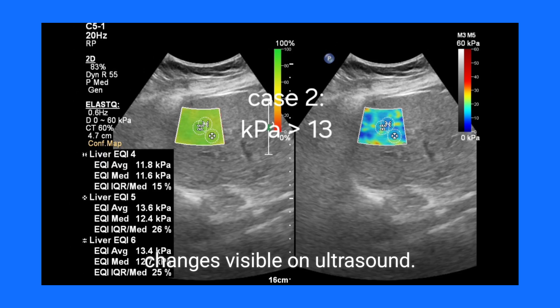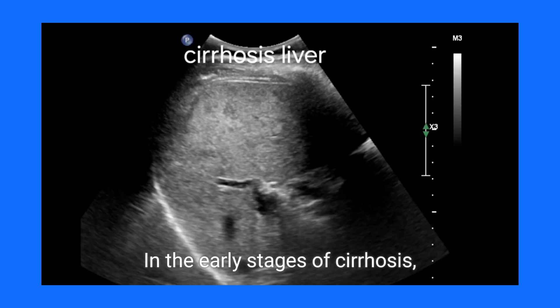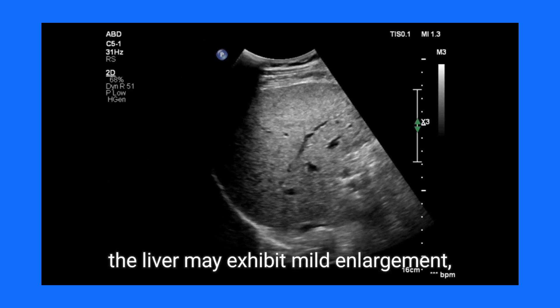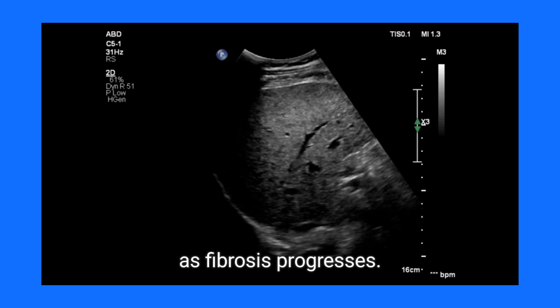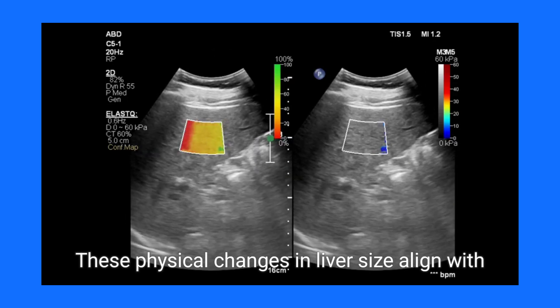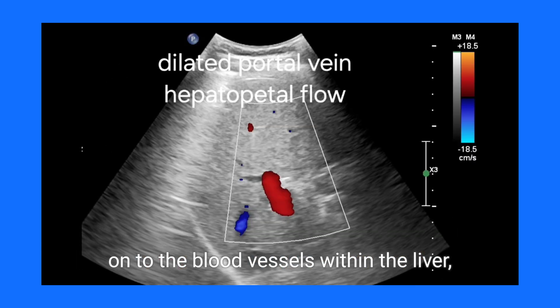Additionally, there may be slight alterations in liver size. In the early stages of cirrhosis, the liver may exhibit mild enlargement, while subtle shrinkage in the right lobe may occur as fibrosis progresses. These physical changes in liver size align with the moderate increase in stiffness detected by FibroScan.